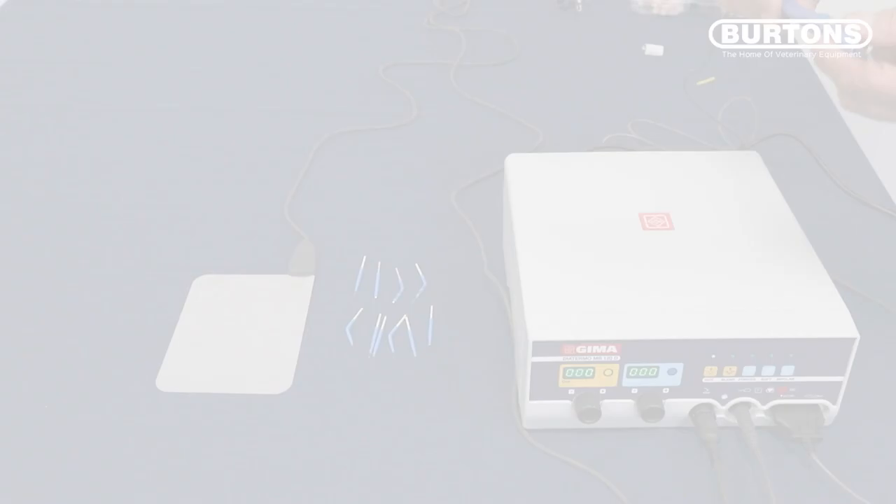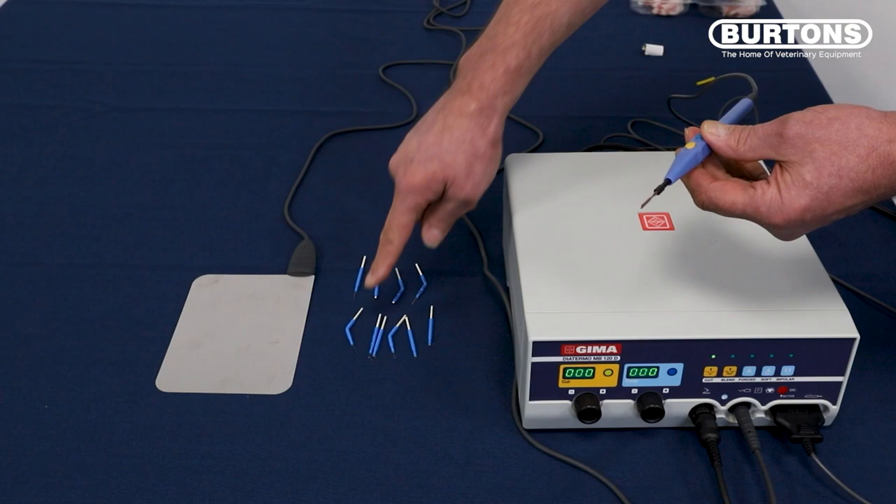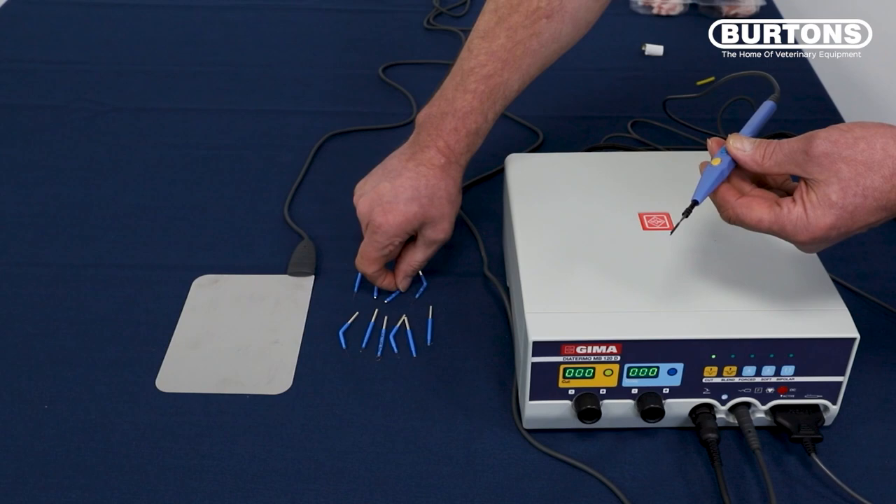The handpiece comes already installed with a spatula tip, but there are several other styles as well. You have a fine wire tip for making fine incisions, loop tips and ball tips, and there's also a hook.